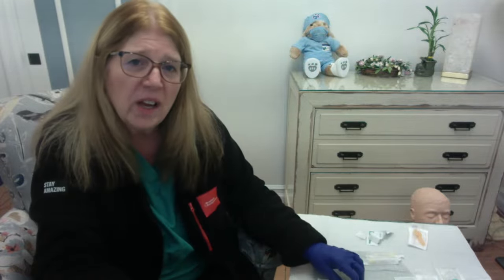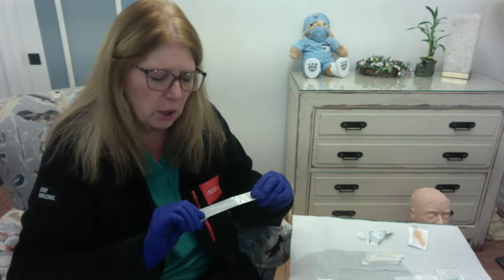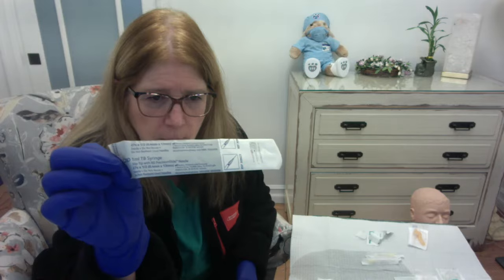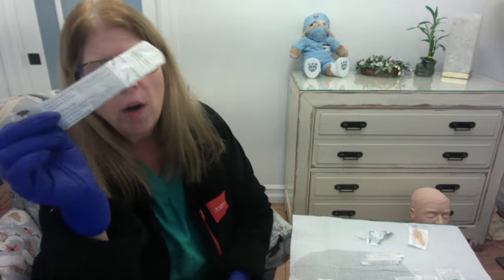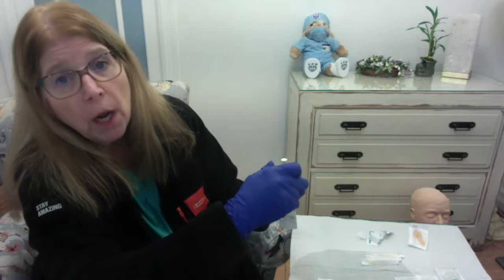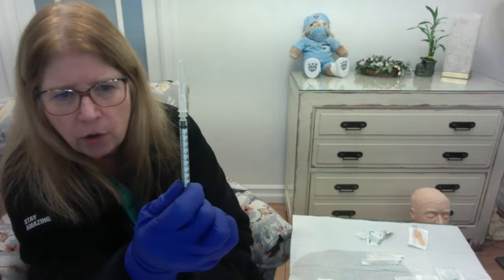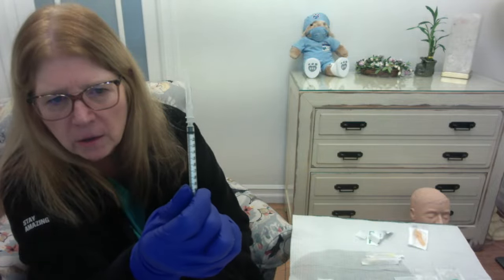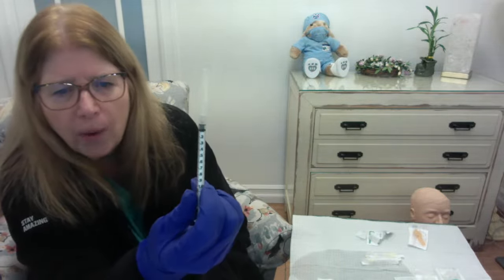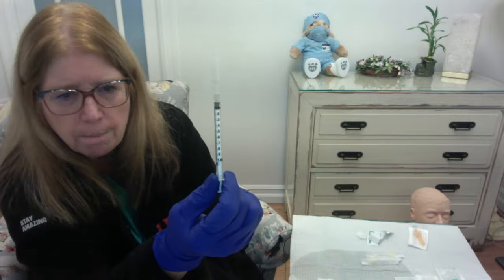So we're going to pretend we're going to give a PPD, all right? Believe it or not, there is a specialized tuberculin syringe, and this is what it is. And you see right here, it says 1 milliliter TB syringe. What is unique about this syringe is that it is calibrated in 1/100ths. It is the only syringe that comes calibrated in 1/100ths, and you can see all those tiny little lines, and each of the larger lines are equal to 1/10, okay? But the whole syringe holds 1 full milliliter.